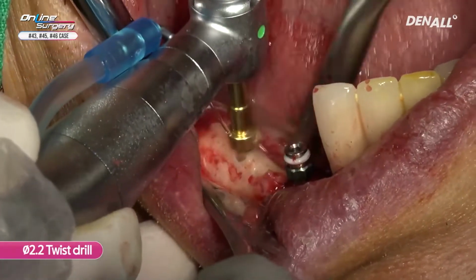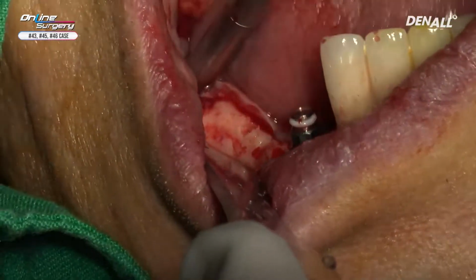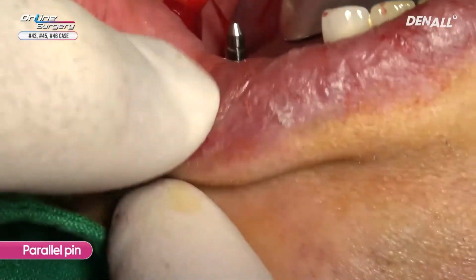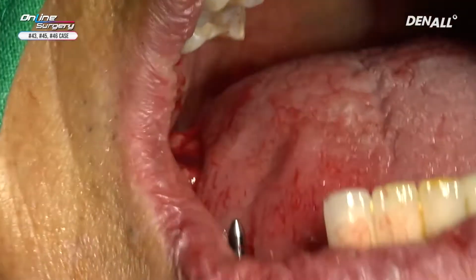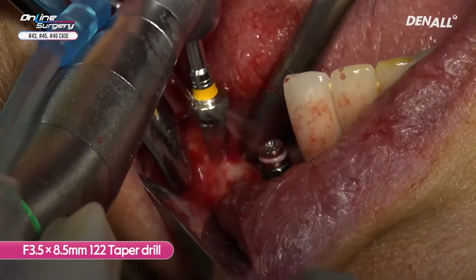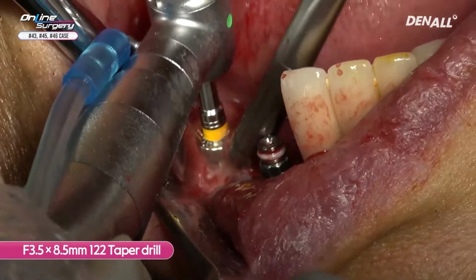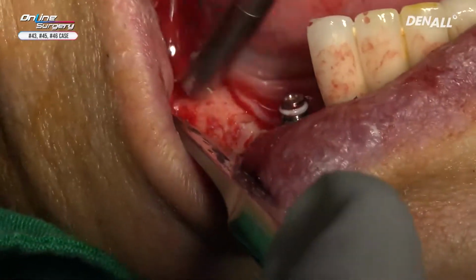Don't swallow. Close slightly. Are you in pain?